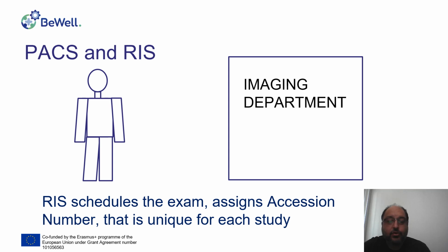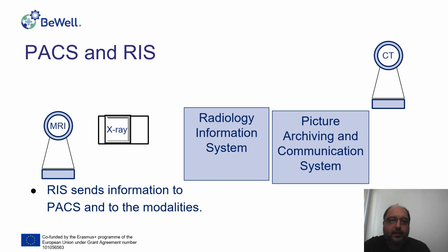Then the radiology information system schedules the exam and assigns the accession number. We spoke about this. The accession number is unique.